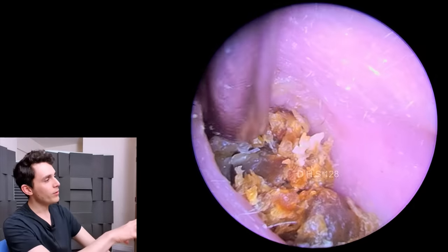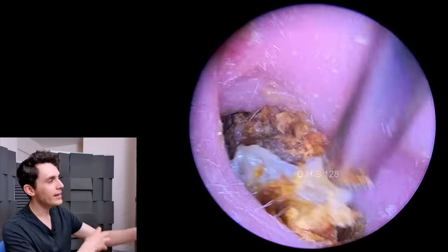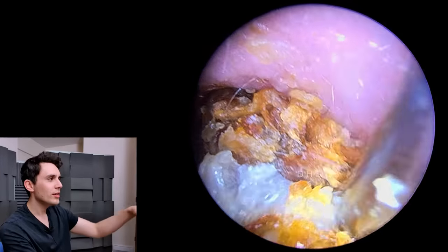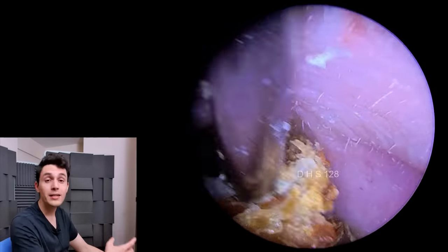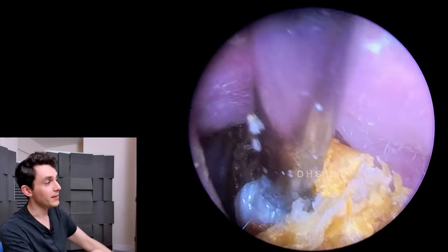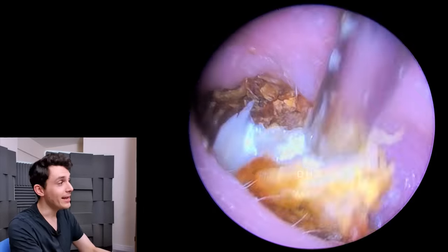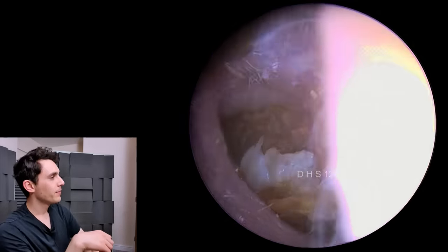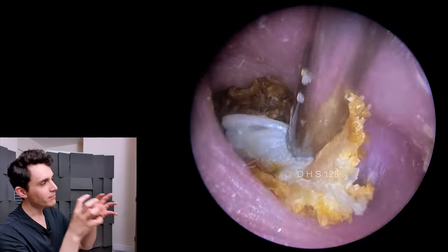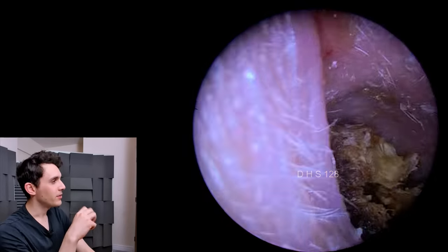At this point the hook has done a lot of leveraging already. What I'm trying to do here is just wiggle it out of the ear canal because it's really at the entrance now. You can see the different sheets of skin have different colours — the lighter and paler it is, the newer the skin or the more recently it's been shed. That white sheet of dead skin has probably very recently been shed, hence why it's in the outer layer. Wiggling, wiggling — this clearly isn't working. I thought I could maybe reach for a larger scoop to try and get it out, but it's just clinging on for dear life.